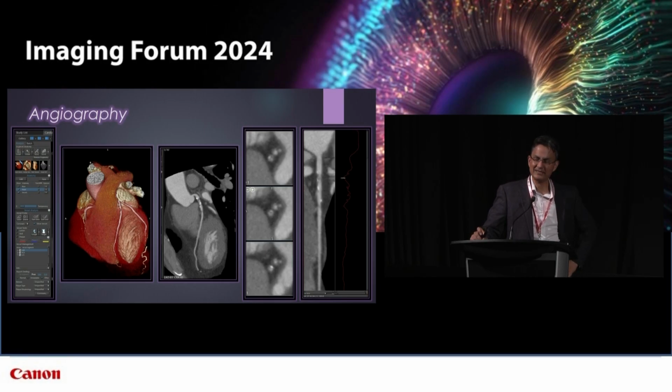And unfortunately, talking about truth, sometimes you just don't believe curved MPRs, and you really want to interrogate those suspicious segments carefully, because it may or may not, if it's the only segment involved, drive further downstream testing. So it's pretty important, I think, to do that.